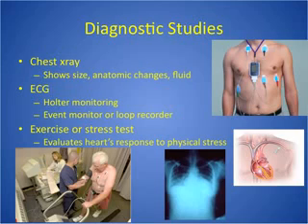And we do this monitoring when they've had symptoms, maybe shortness of breath or fluttering in their chest, and it's kind of at varied times. And so they can put them on the Holter monitor for 24 to 48 hours at home and see what's really happening. And they would monitor their symptoms. They had symptoms, they'd mark it, that kind of thing.